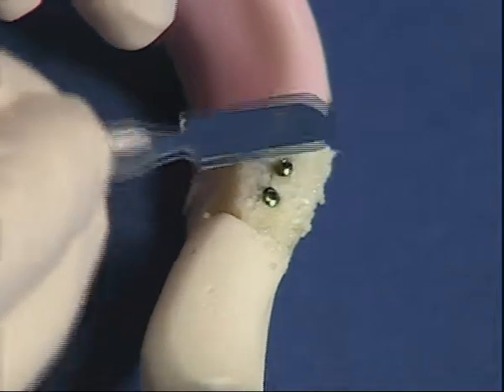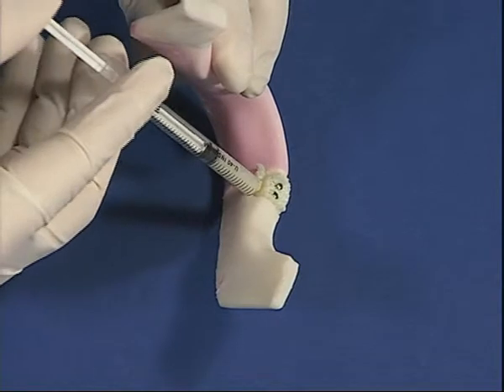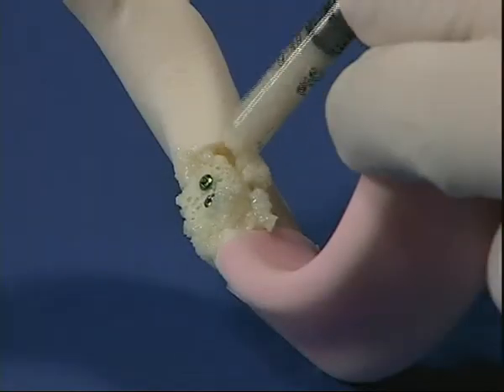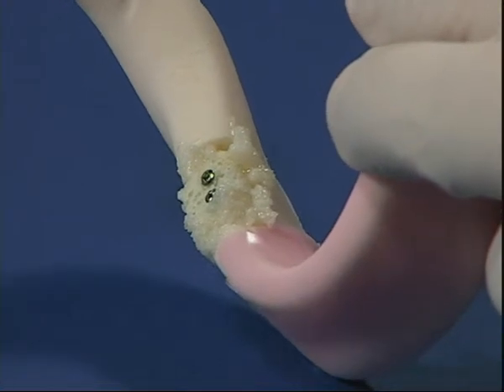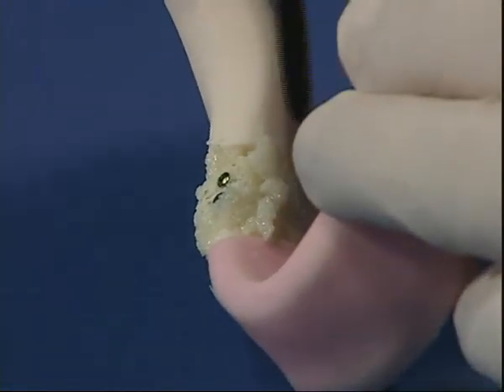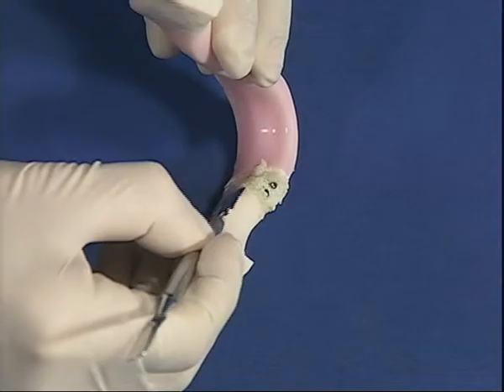The Bioteck bone tissues can be used together and are complementary. Here you can clearly see how both the block form type of tissue and the granules have been employed to reconstruct the cavity. Bioteck offers dental surgeons a complete range of bone tissues.